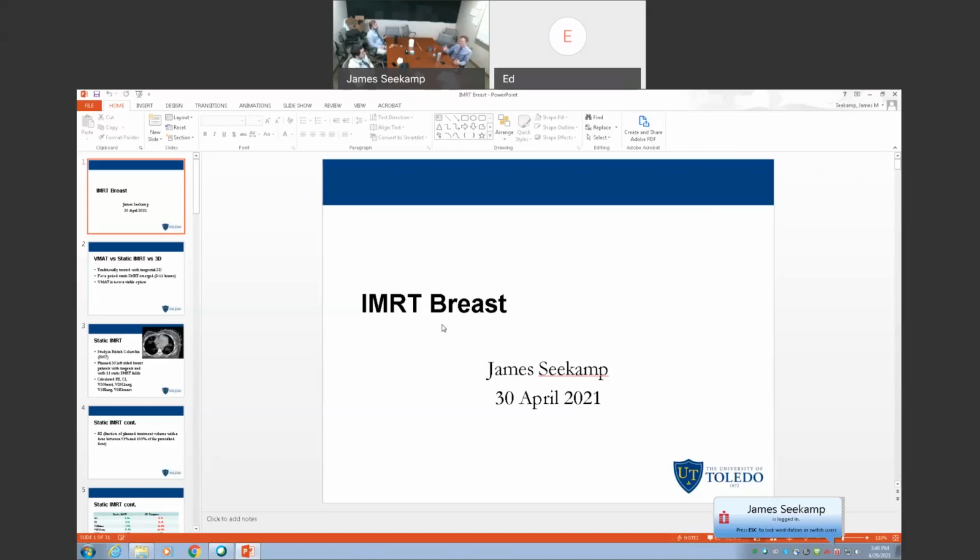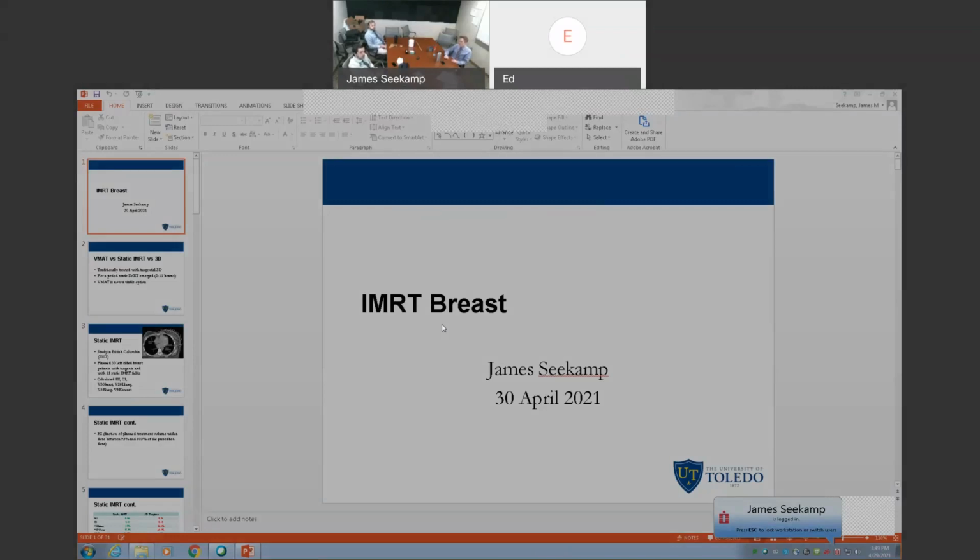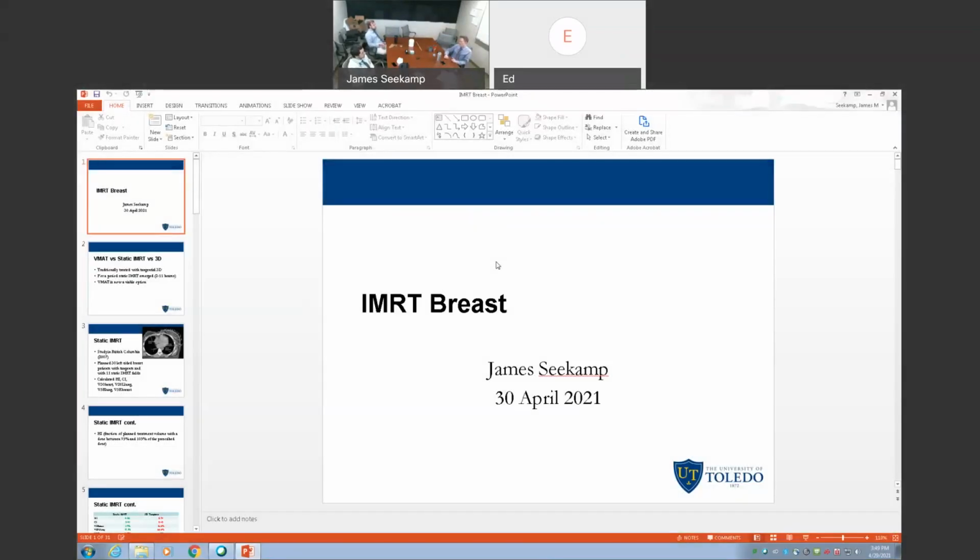And she actually had a lot of swelling below that, and so what we were lining up to, what we had planned to, was a PTV of a certain volume, and we were running into issues where she had swelled up a lot, and it was a lot different. And then, you know, even with 1 centimeter of robustness, that might not have been sufficient for her. So, but it's nice to be able to see at what point are we getting to the point where we're going to have to do something else. Robustness with 1 centimeter isn't going to cut it.